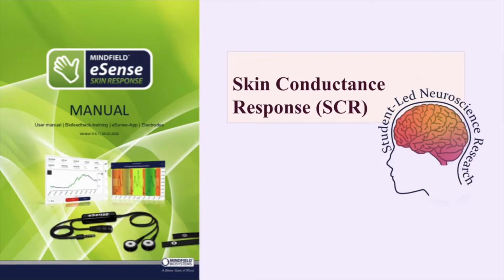Hello guys, today we're going to be talking about the skin conductance response. We're going to be using the Mindfield eSense Skin Response Manual, and I recommend anyone here go check that out. It has a lot of useful tips and tricks on how to use the SCR device we will be using by eSense, so definitely recommend checking that out. Now let's get right in.